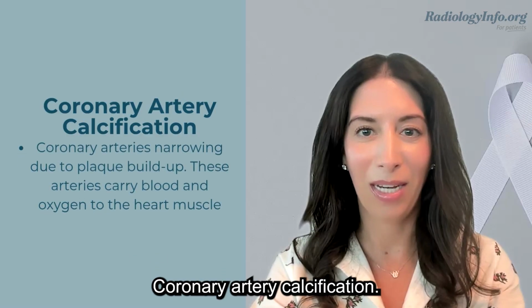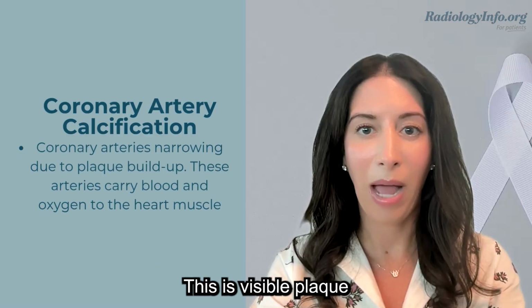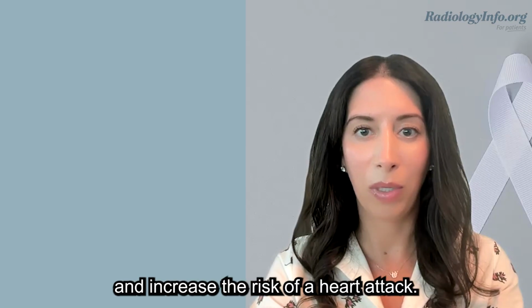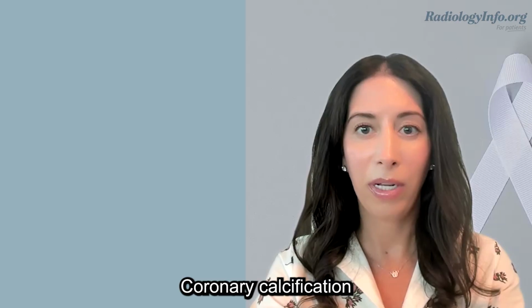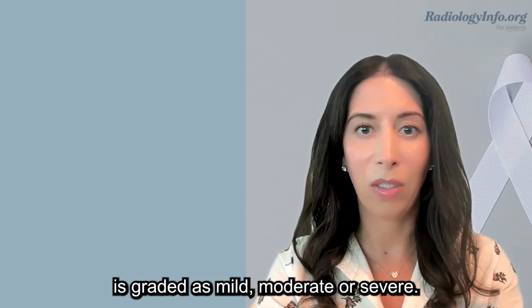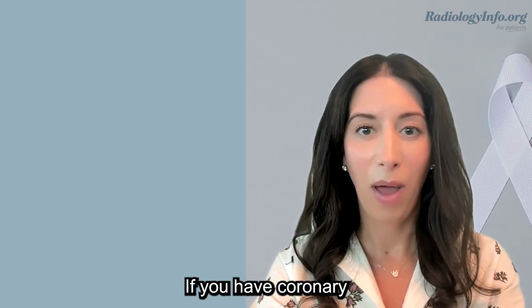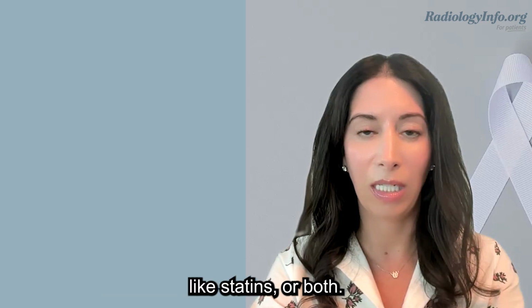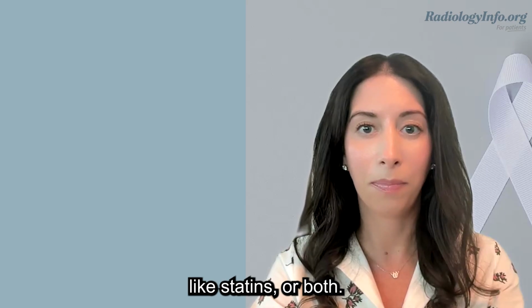Coronary artery calcification. This is visible plaque in your heart's blood vessels. Plaque can narrow the arteries and increase the risk of a heart attack. Coronary calcification is graded as mild, moderate, or severe. If you have coronary artery calcification, you may need to make lifestyle changes, take lipid-lowering medications like statins, or both.